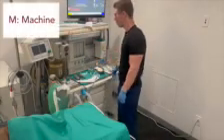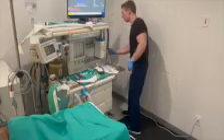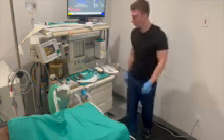We'll be using MSMAIDS. The first M stands for machine check. After the full machine test is completed, we also want to check for an alternate source of oxygen and ventilation. An ambu bag will often be hanging on the side of the anesthesia machine or by the anesthesia med cart.